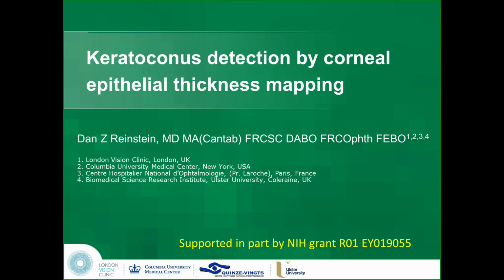I am going to lecture now on detection of keratoconus, but with the addition of a new parameter, a new tool that has been introduced over the last 10 years, and that is the epithelial thickness map.